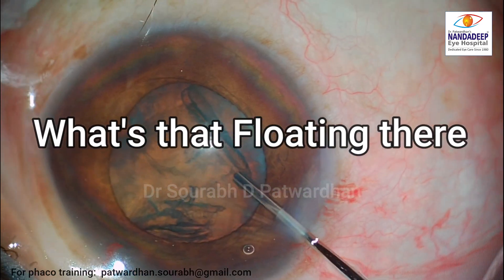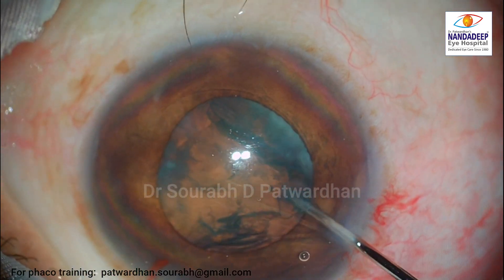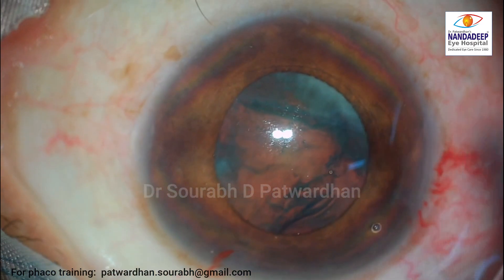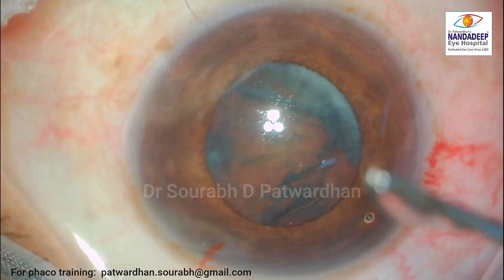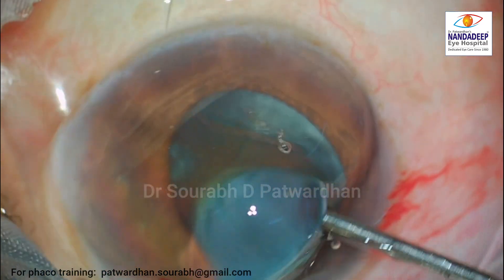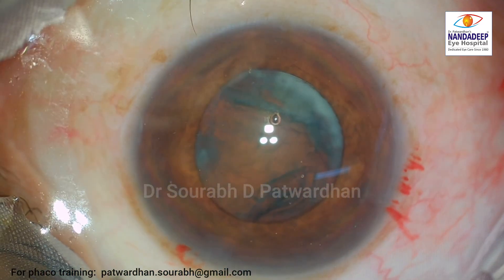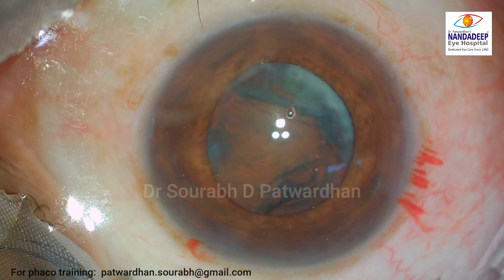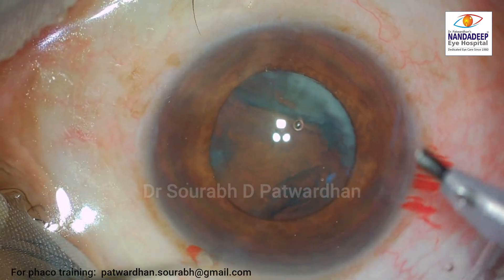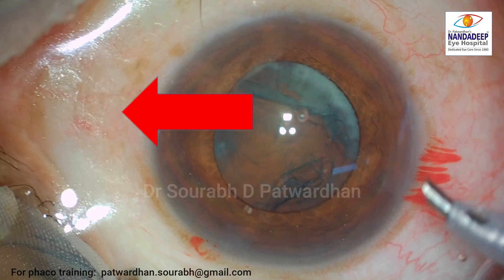In this video, I am demonstrating a case of cortical cataract and my plan is to implant a trifocal IOL. The patient needs good distance, intermediate and near vision, and the patient's ocular conditions are fit for trifocal implantation, so I have decided to put a trifocal IOL.